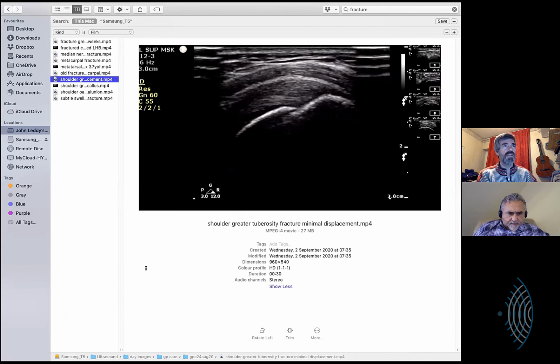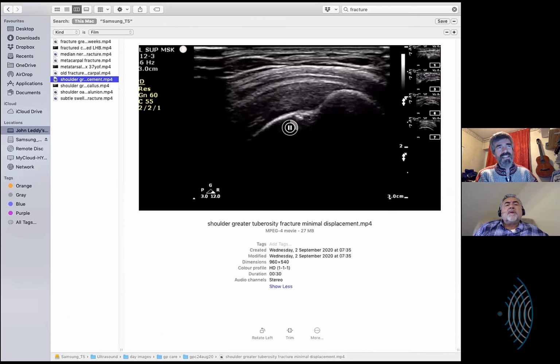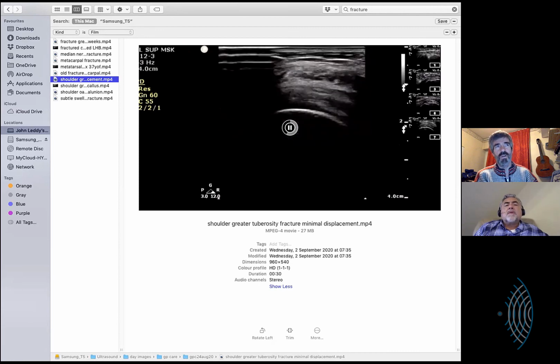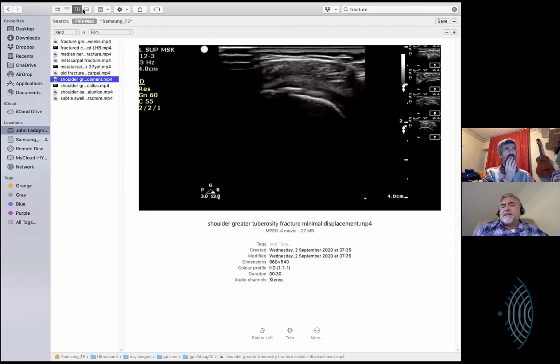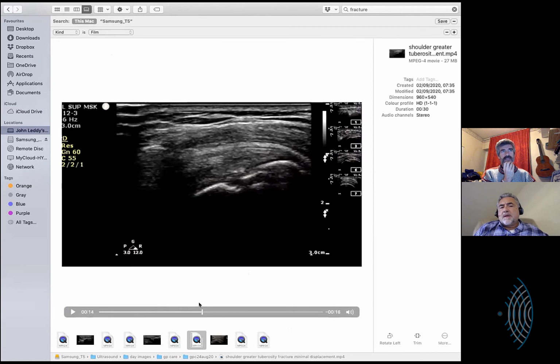Yeah, this should be more like it. See that? Yes, I do. Yeah, that's an ambiguous one. That's the sort of thing where I would be 50-50 because of where it is, but you can see some of it is more obviously fractured. When you see the discrepancy in the line of the periosteum, or that cortical area, what else could it be? Does the body just all of a sudden lay down this step off, or is there something because of the anatomy? Yes.